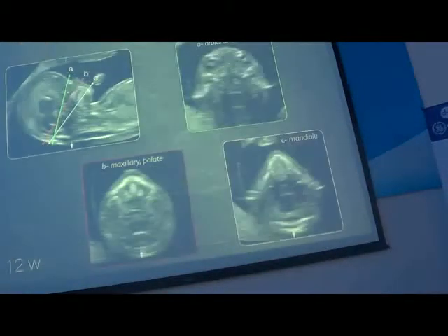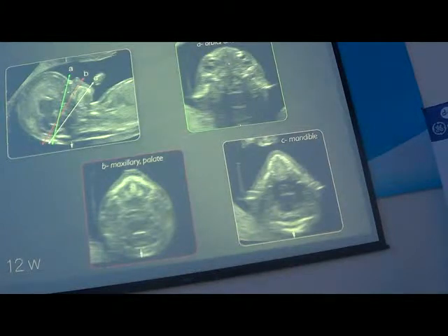Now we will start with the first trimester. What is possible to see? Bây giờ tôi sẽ trở lại với thời điểm 3 tháng đầu. Cái gì chúng ta có thể nhìn thấy ở đây? This is from a 3D block, 3D volume, the different section. On this one, the green one, you can see the eyes and the ear. Với hình ảnh 3D ở đây thì với lát cắt A màu xanh sẽ cho phép chúng ta nhìn thấy mắt và phần tai.